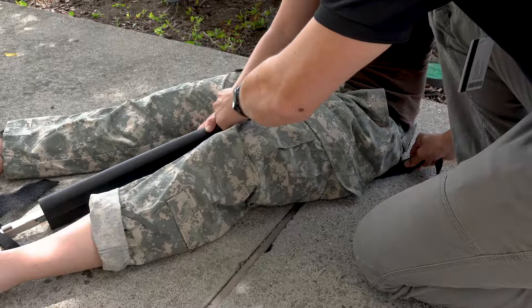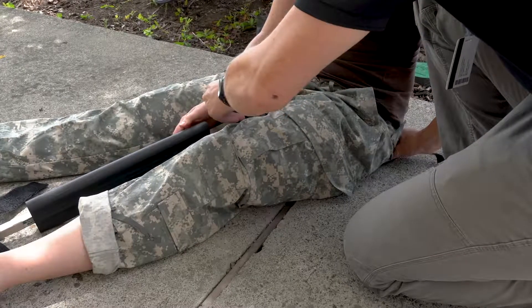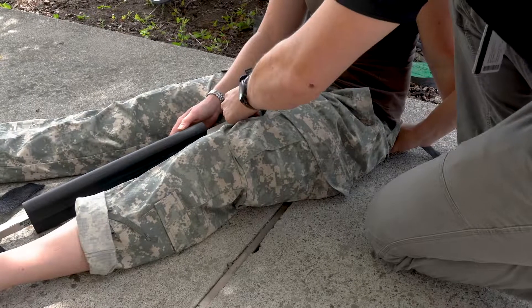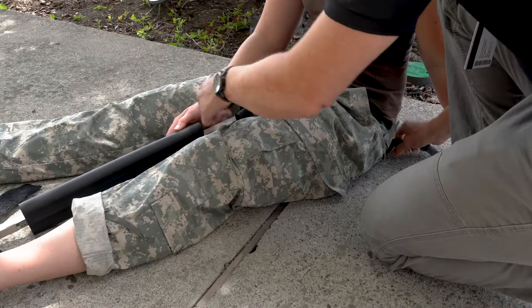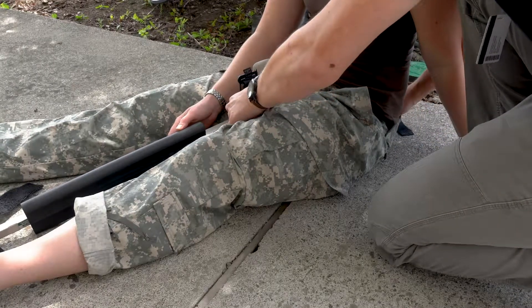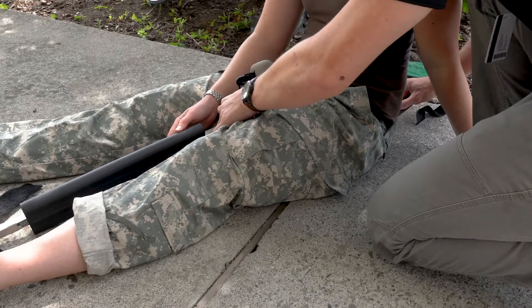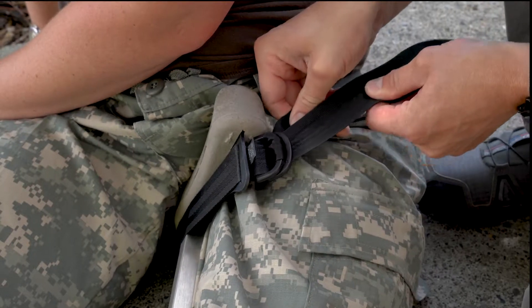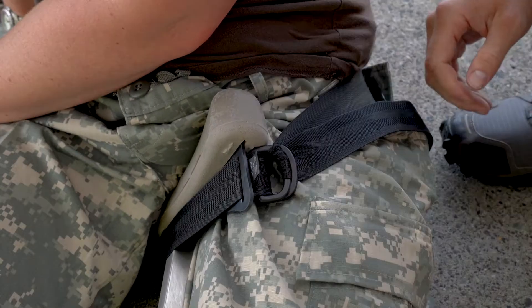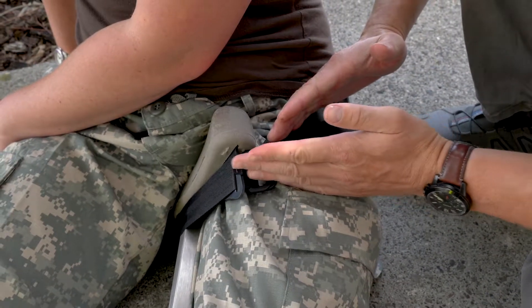When securing the ischial strap, use a gentle back and forth motion to slide it up over the ischium — the bone on the bottom of the patient's pelvis. Communicate with your partner supplying manual stabilization to avoid displacing the leg. Leave a little extra loop of slack so that you can pull tension and slide the strap up until it's tight. Carefully tighten the ischial strap using opposing force in order to not displace the extremity. It's important that the strap is positioned high on the patient's hip to avoid pulling on the upper femur and displacing the bone ends.